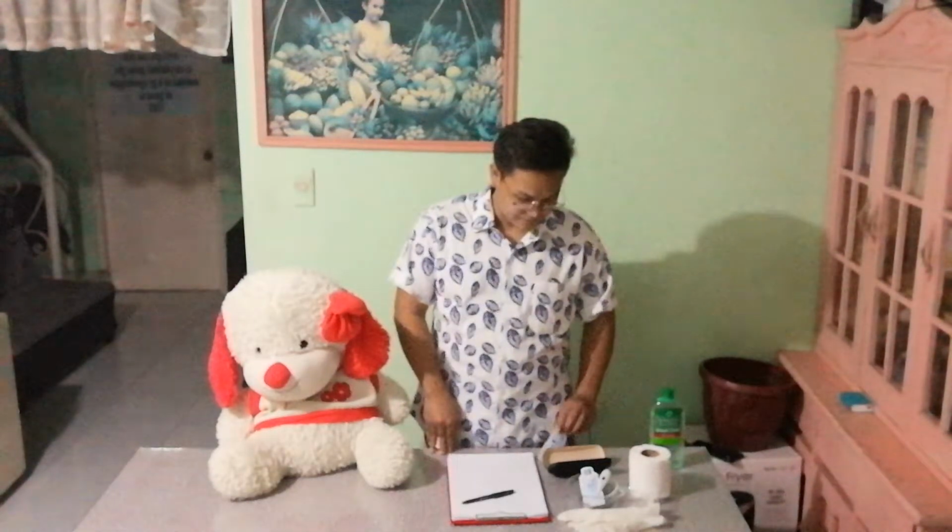So the first step is, if necessary, push the on button and wait for the ready signal of the unit. Number two is we need to attach the tympanic probe cover.